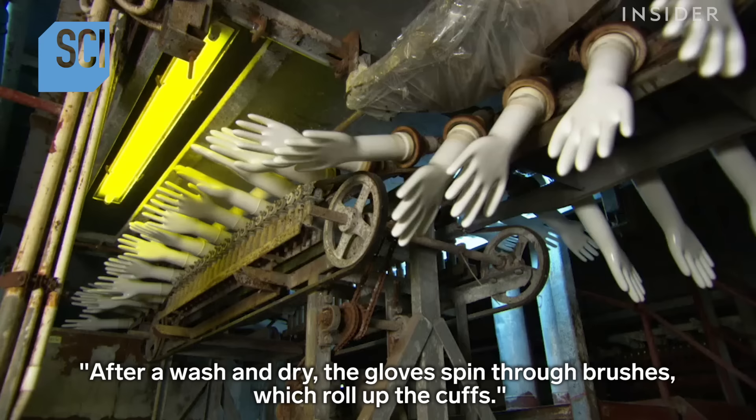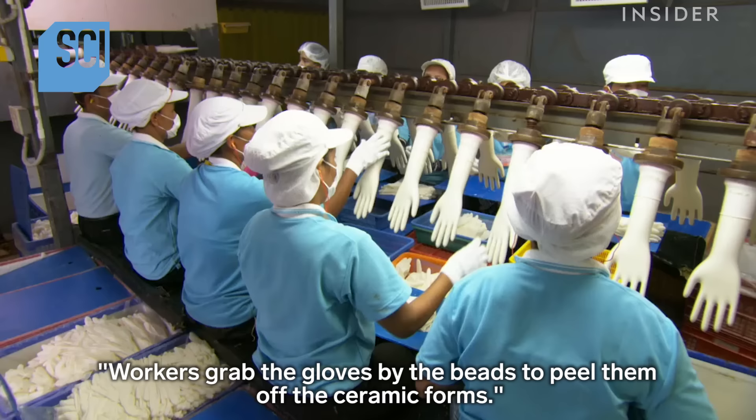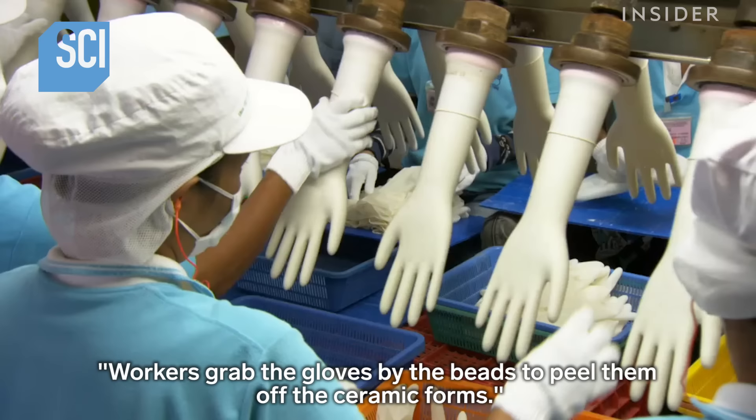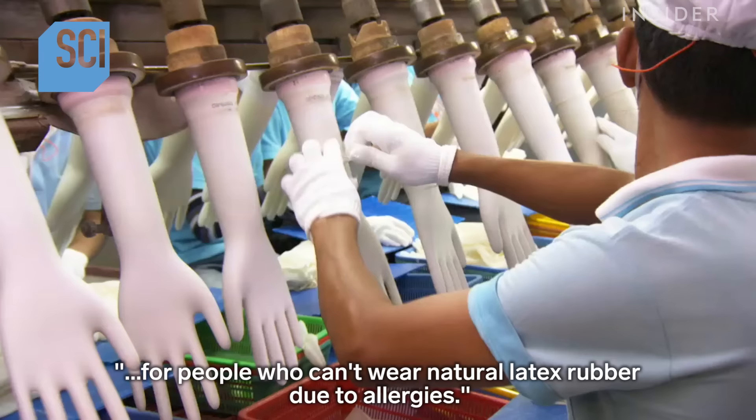After a wash and dry, the gloves spin through brushes which roll up the cuffs. This cuff roll, called the bead, has a specific purpose: it makes it easier to pull the rubber glove off the mold. Workers then grab the gloves by the beads to peel them off the ceramic forms.